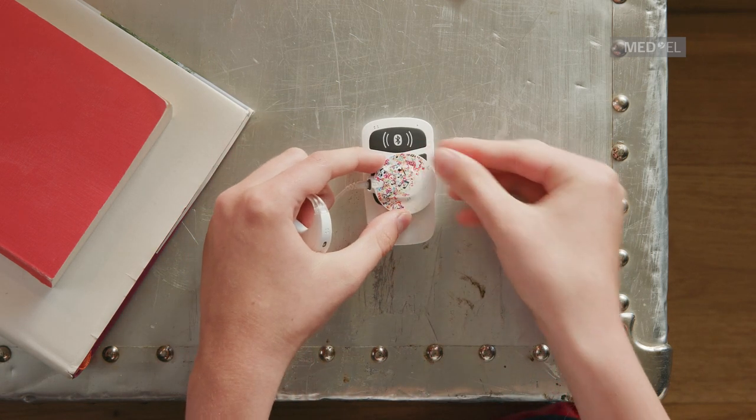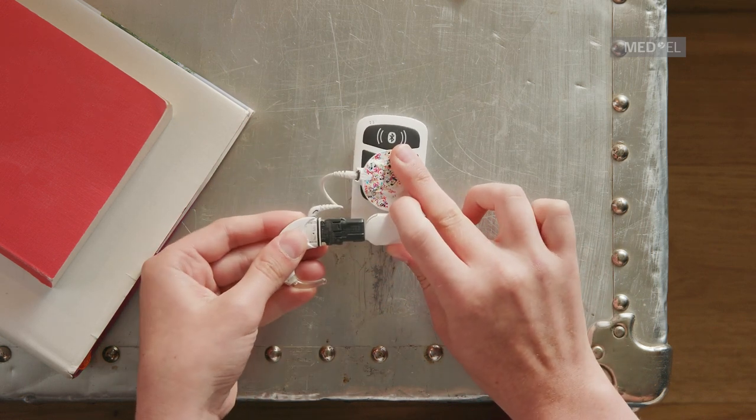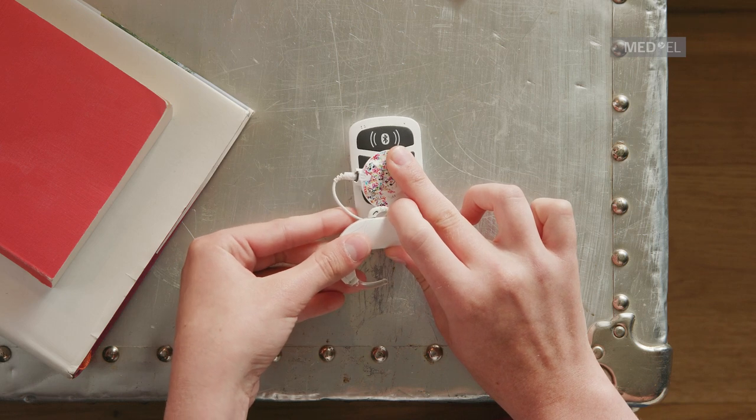If you are a bilateral user, make sure you pair both your audio processors one after the other using the same procedure as before.